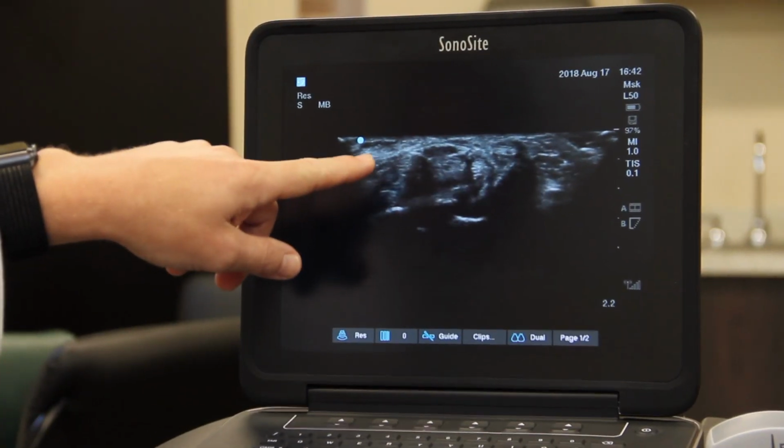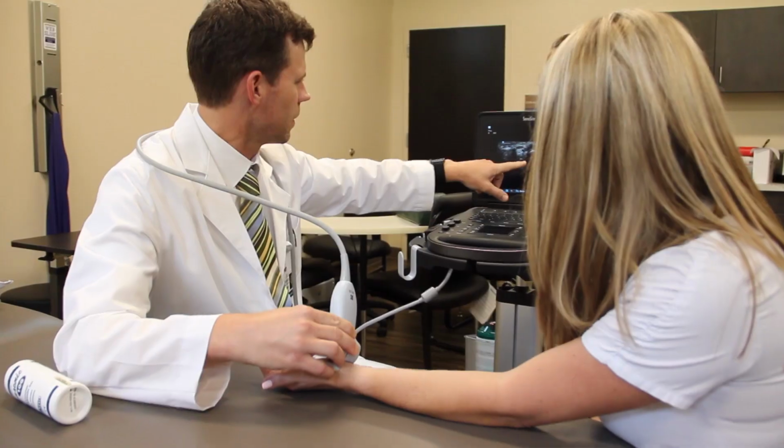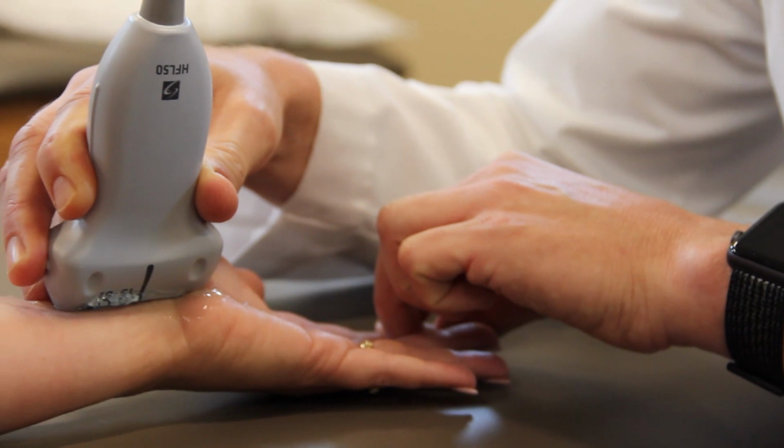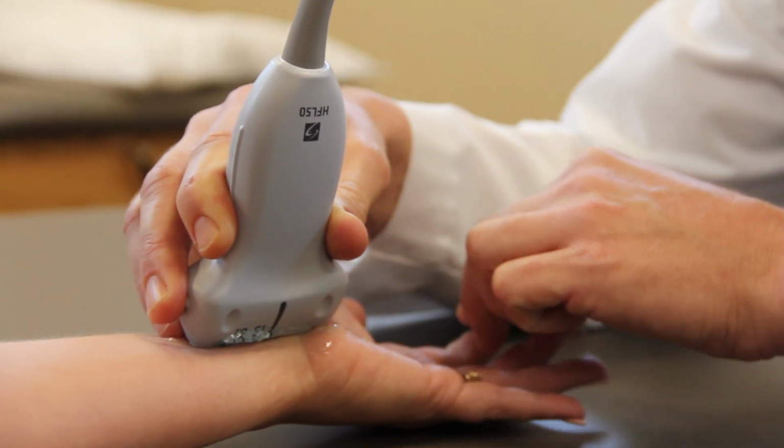Now, come to modern day, we've added one other element to help us diagnose a patient with musculoskeletal problems, and that's the ultrasound. The ultrasound allows us to take images of joints, muscles, tendons, and ligaments just like an MRI, but in dynamic or real time. Now we can actually see the joint move right before our eyes.